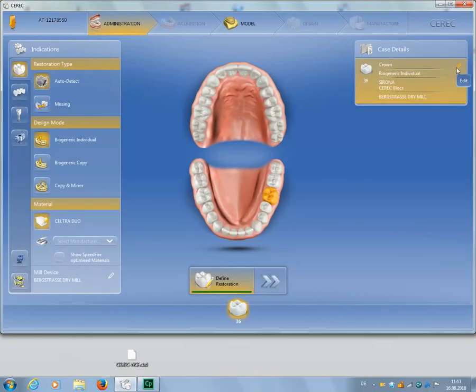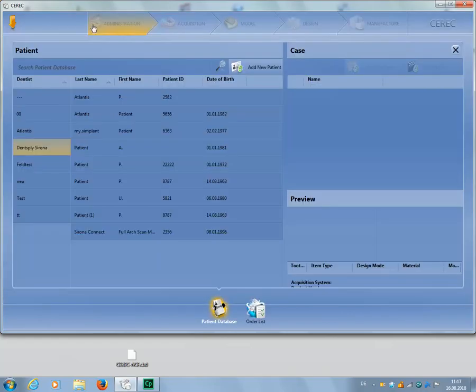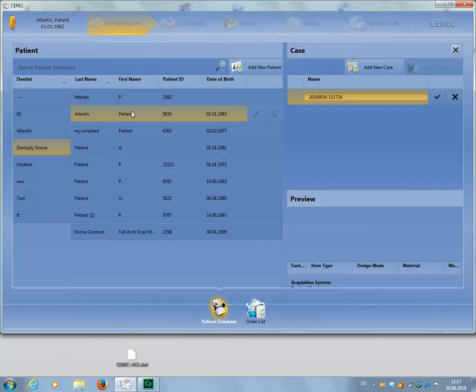Then we save the case by reopening the system menu, where we select the option Save As this time. In our case, the patient has already been created in the database, and we're adding a new case for this patient. At this point, you have the option of giving the case a unique name. We delete the last numbers and add the name Core File. Finally, we save the case by clicking the checkmark.